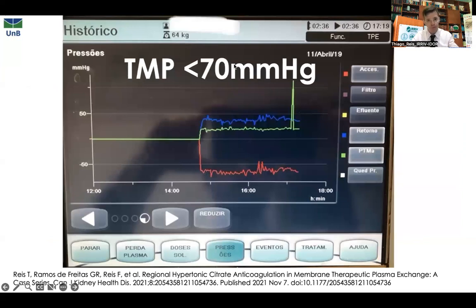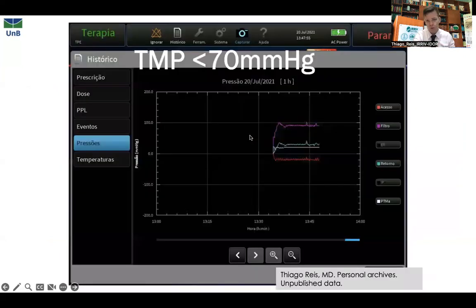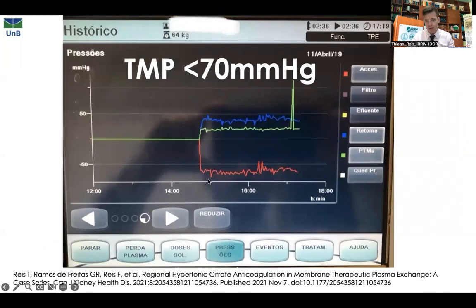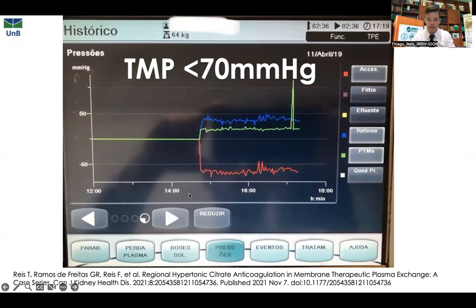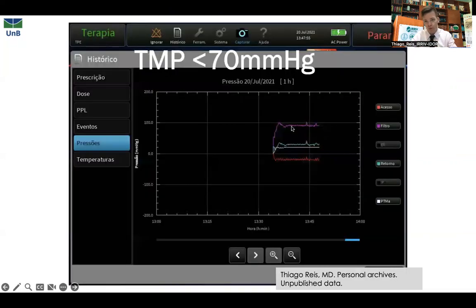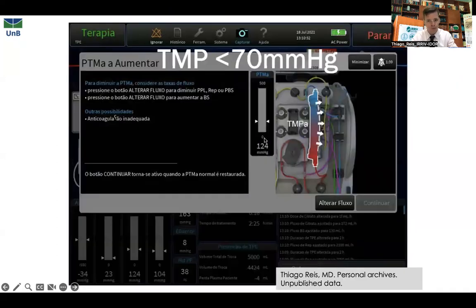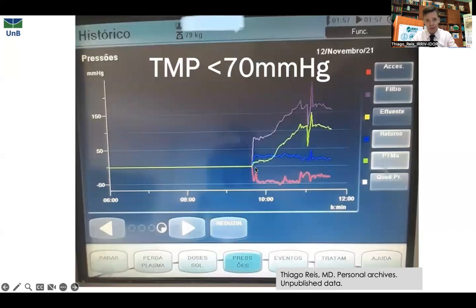It is important when applying membrane plasmapheresis to respect a maximum transmembrane pressure (TMP) of 70 mmHg to avoid fiber rupture. In this image, therapy started at 1 pm. The red line shows inlet pressure (always negative, around -60 mmHg); the blue line shows outlet pressure (always positive); and the green line shows TMP, which was below 70 — around 20 mmHg in this case. We encountered a problem where TMP began to rise, but were able to finalize treatment before fiber rupture.